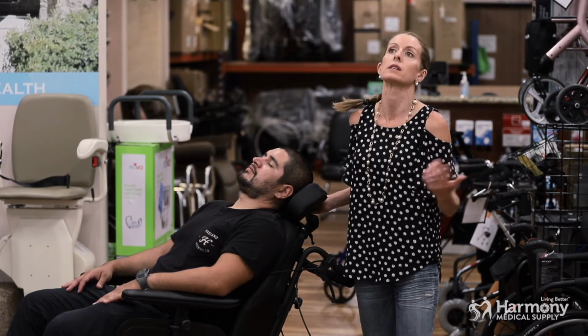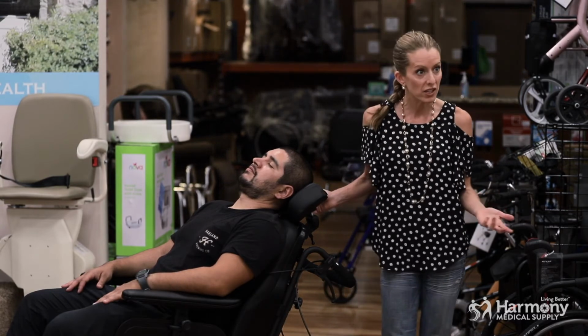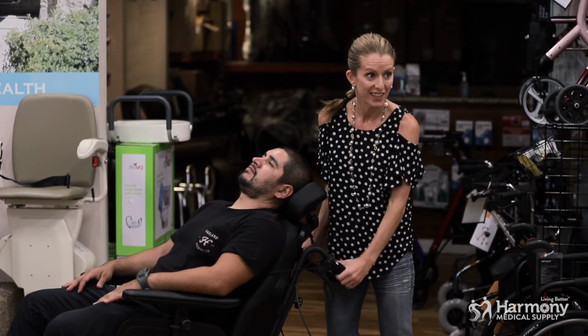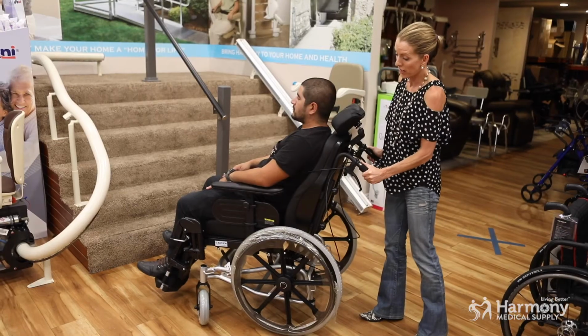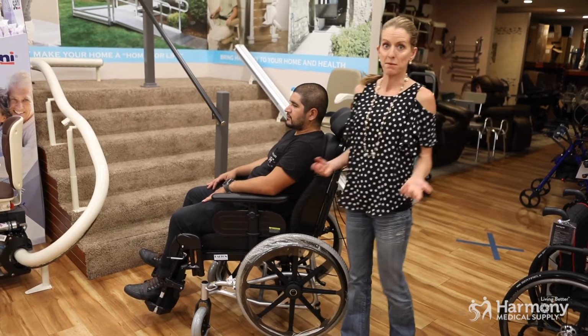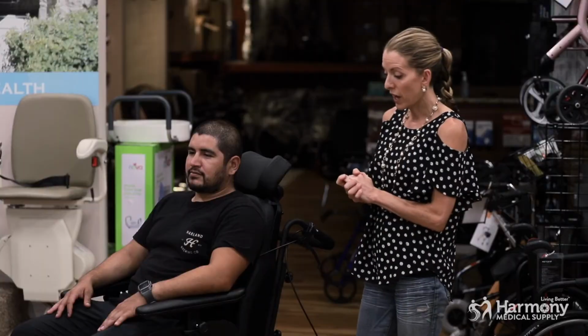They'll start to release and to let go into that more often, and use our friend gravity to get them there. Gravity via tilt and recline. So those are positions that a regular manual chair can't do. Not to mention, it makes napping a whole lot easier. So that's our tilt and recline chair.